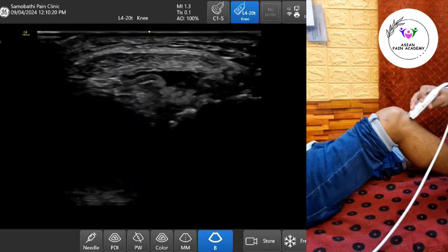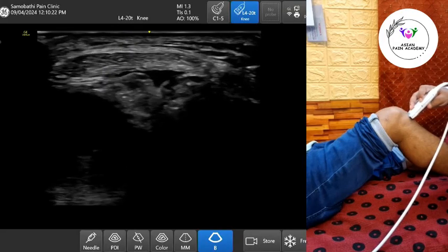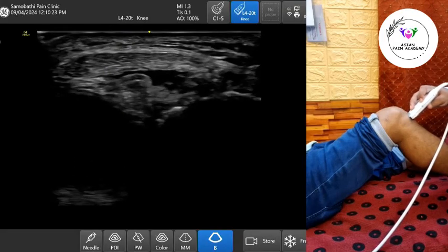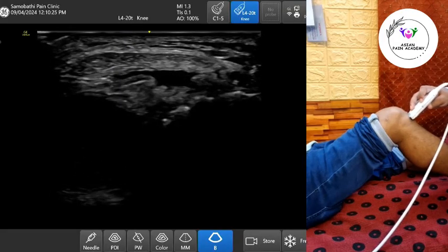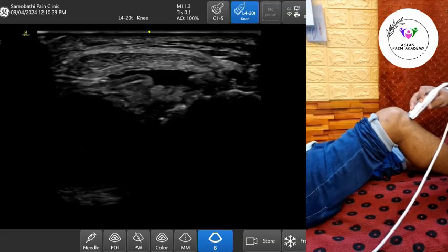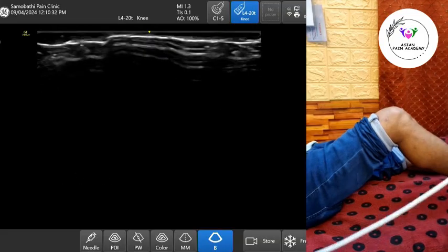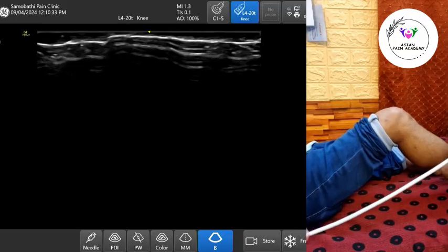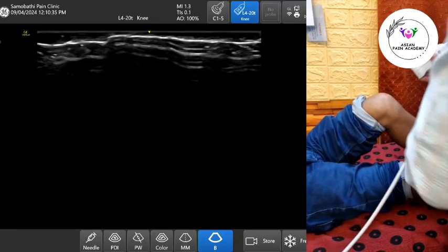In normal conditions, this bursa is not visible on ultrasound. However, in cases of bursitis — often due to microtrauma, repetitive kneeling, or post-traumatic inflammation — the bursa may become distended with fluid and symptomatic.